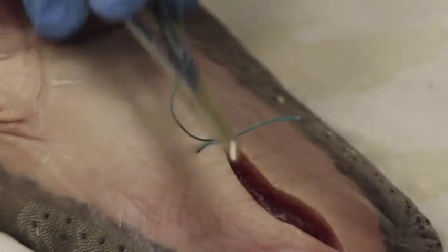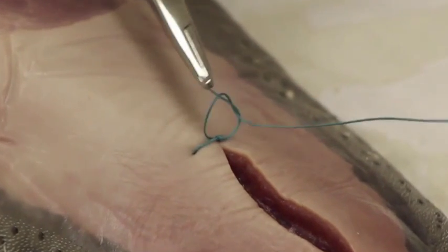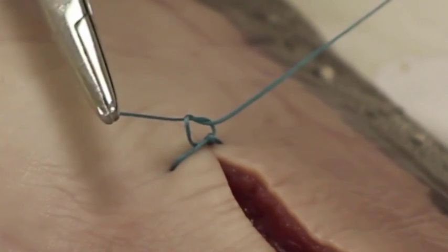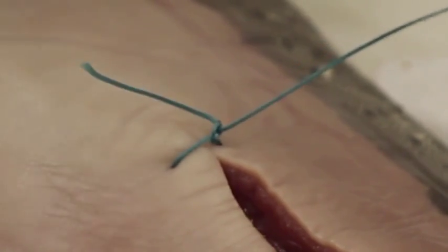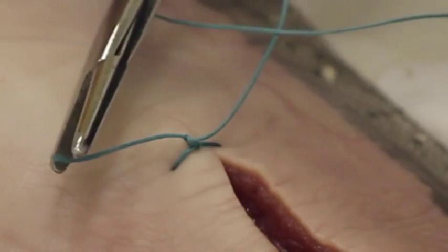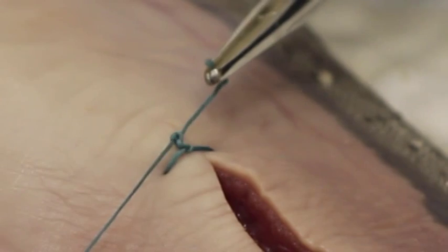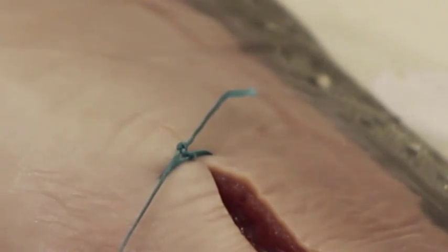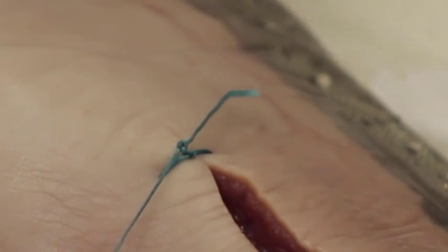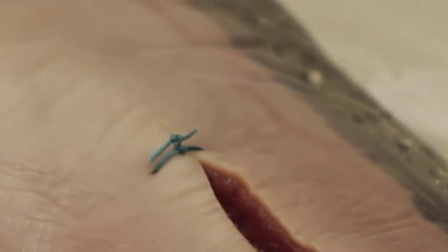Now they convert it to a square knot. Put the driver in between, wrap it once, and you see how I come down flat. Again put it in between and come down flat — and that's the end of my slipknot. Then I square them and I've got exactly the tension that I need on the skin: not too tight and not too loose.